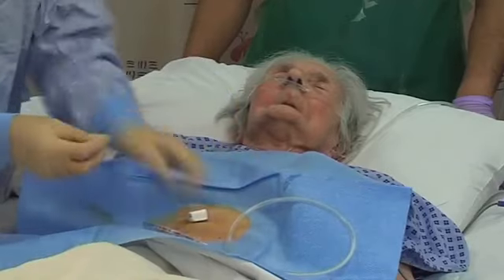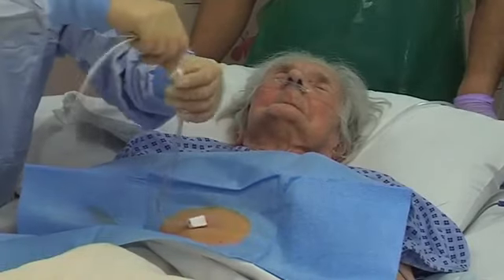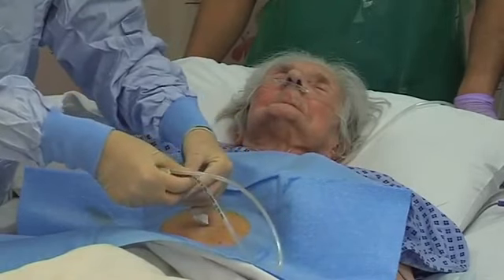Okay, and then you can put the clamp on. I think a common mistake people make is to make the tube too long. Obviously you want it short enough if you're going to remove it later by a traction method, but if it's too long, it does get in the way and can get pulled out.